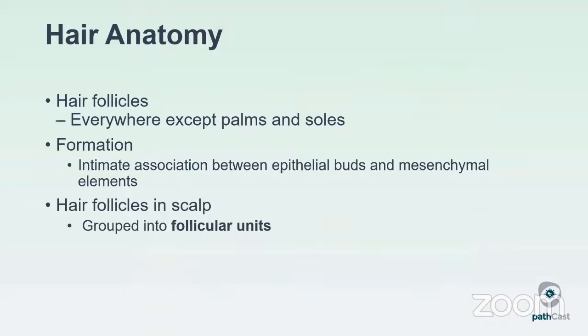All right, next up we have hair anatomy. So again, I warned you I'm going to go into a bit of excruciating detail here, but hopefully you'll appreciate it when you get to your alopecia lectures, because if you can't know what you're looking at, both in vertical and cross section of scalp, understanding the hair follicle, where exactly in the follicle are you, and what stage of the hair cycle it is, you will not be able to sufficiently analyze hair alopecia biopsies.